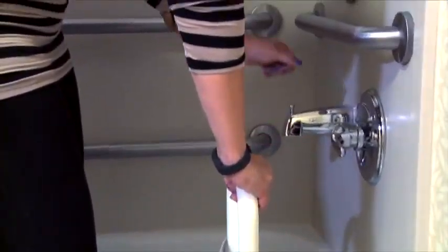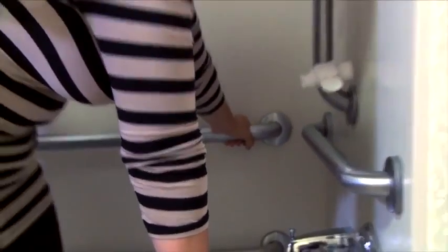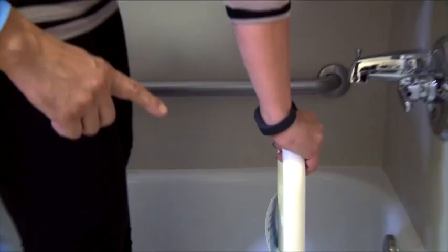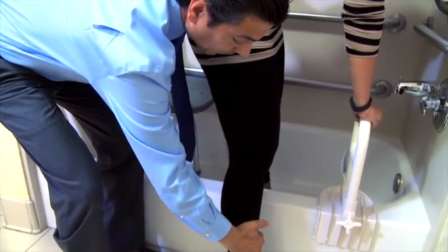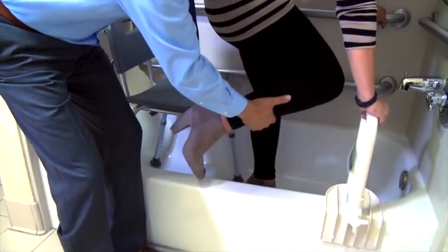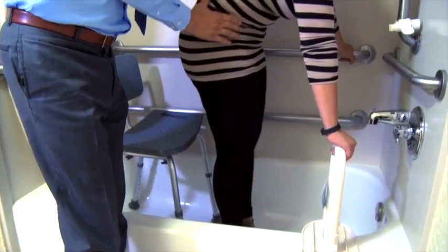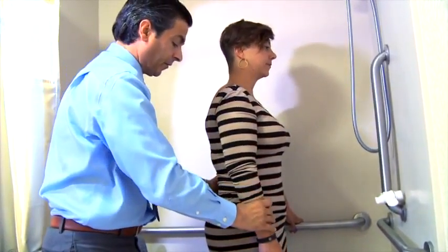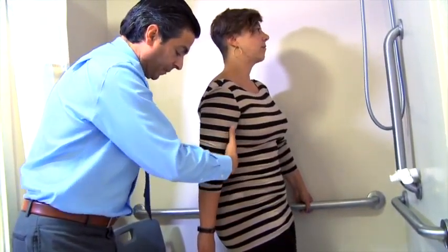Once stable with one foot inside the tub, have them reposition their hands and grab other grab bars inside the tub as available. Then slowly provide assistance for them to step over the tub threshold with the other leg. Once they are balanced, provide assistance to reach back and slowly reach towards the shower seat with one hand before sitting.